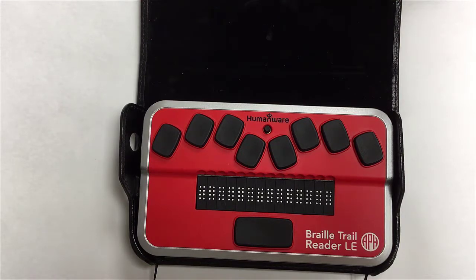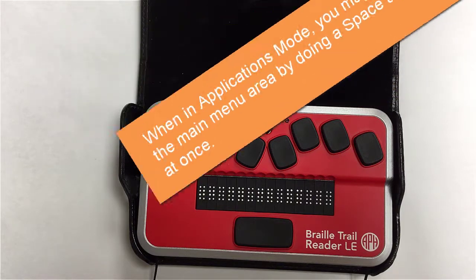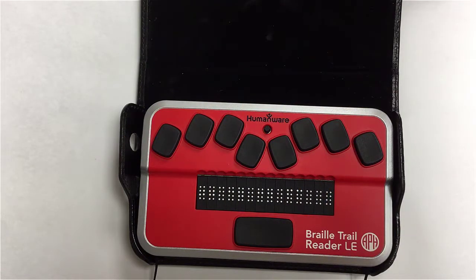From anywhere in applications mode, if you do a space with dots one, two, three, four, five, six — a chord with full cell combination — that will jump you back to the main menu. From there, it'll pop you back to the top, which is going to be the clock, which may or may not be correct depending on whether you've synced yet with your phone.